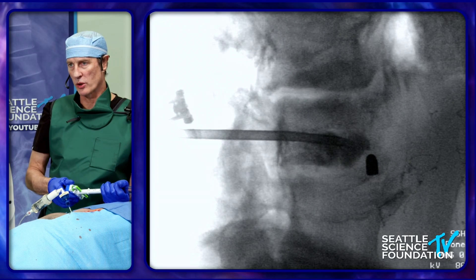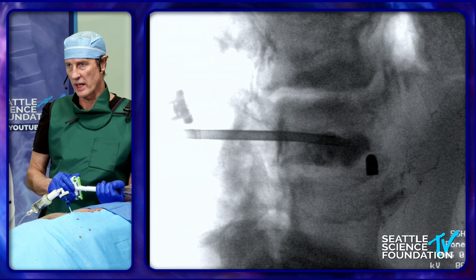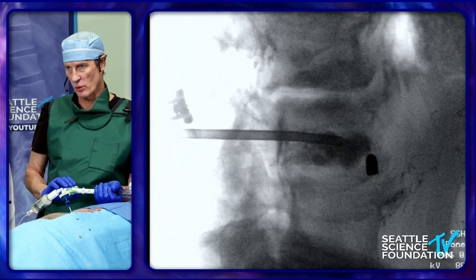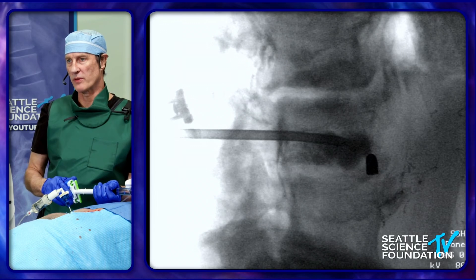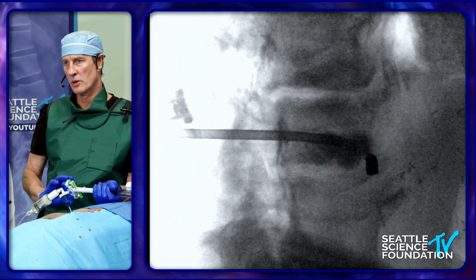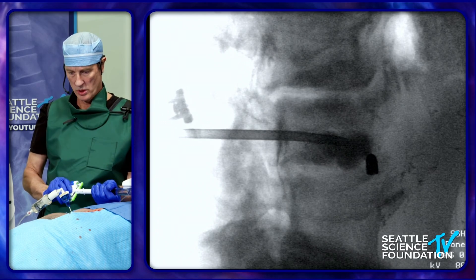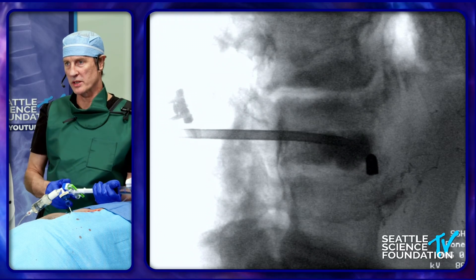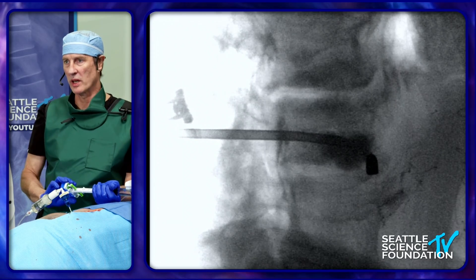The cement will be the darker black, and the contrast will be more gray in appearance. That discogenic sclerosis from this patient is just very obvious and very profound. You can see the cement is going everywhere except into that area of discogenic sclerosis — and that's normal. That's what happens.